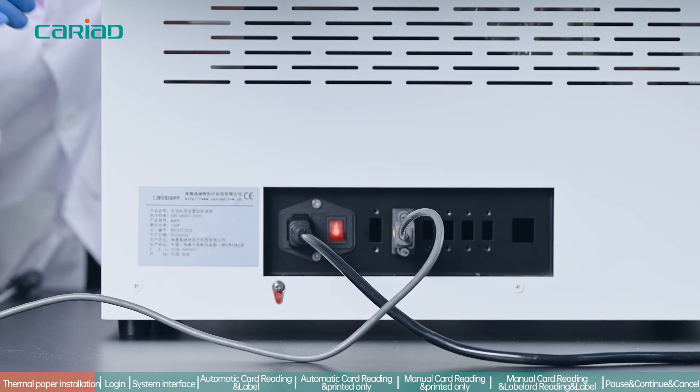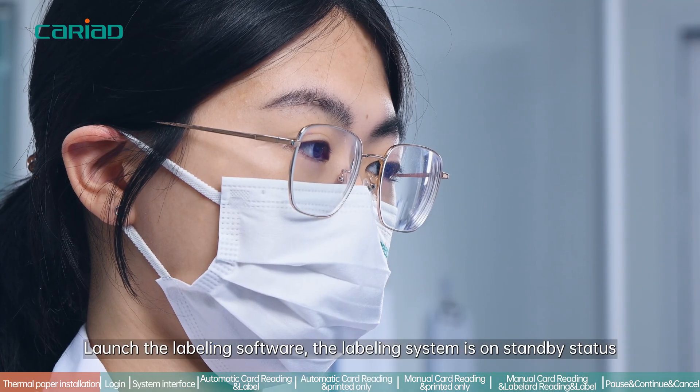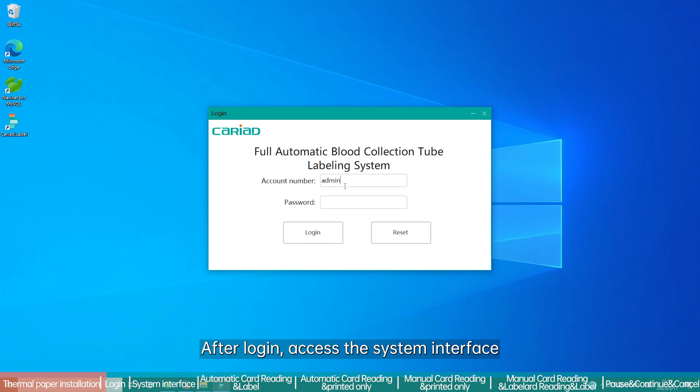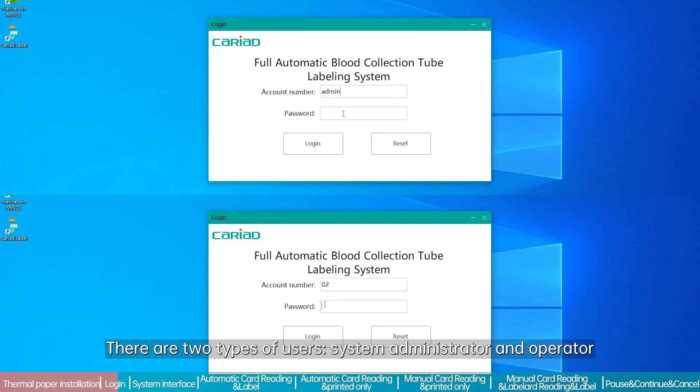Turn on the labeling machine, then the computer, and launch the labeling software. The labeling system will be on standby status. Login with the registered username and password. After login, access the system interface. There are two types of users: system administrator and operator.